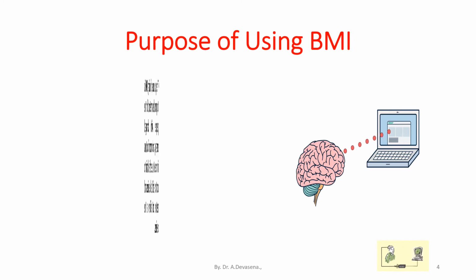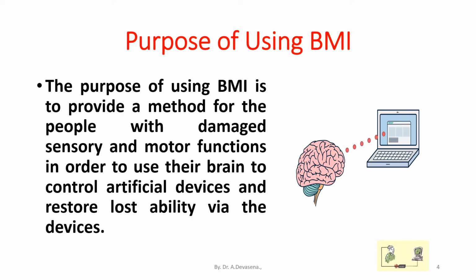Purpose of using BMI. The purpose of using BMI is to provide a method for people with damaged sensory and motor functions to use their brain to control artificial devices and restore lost ability via the devices.